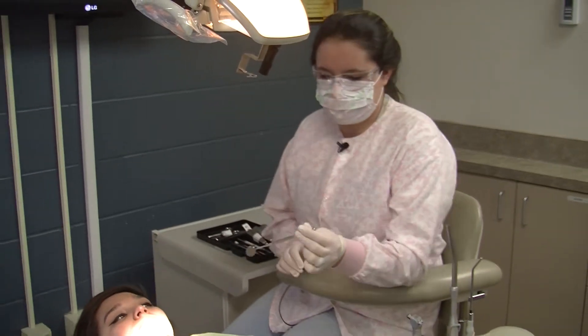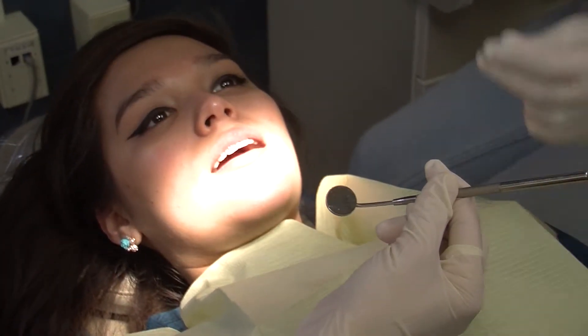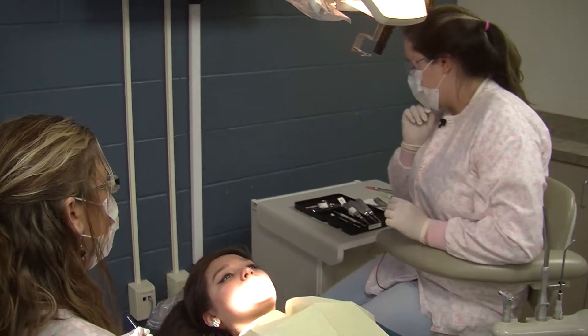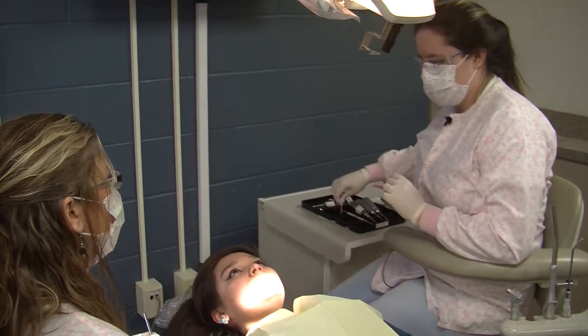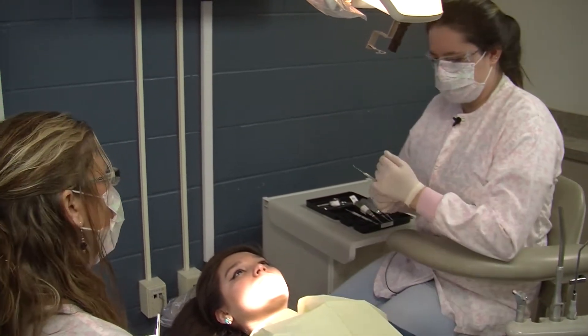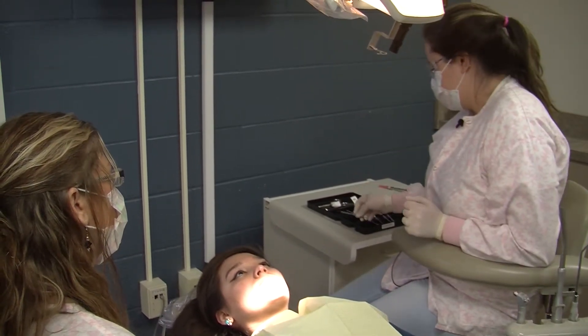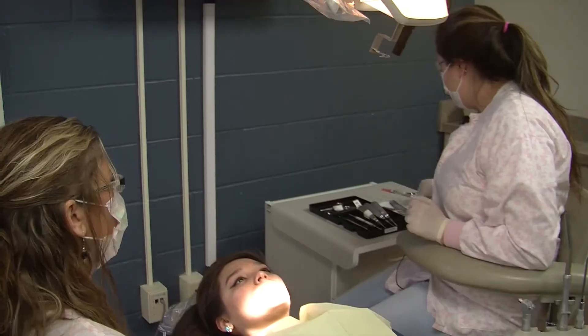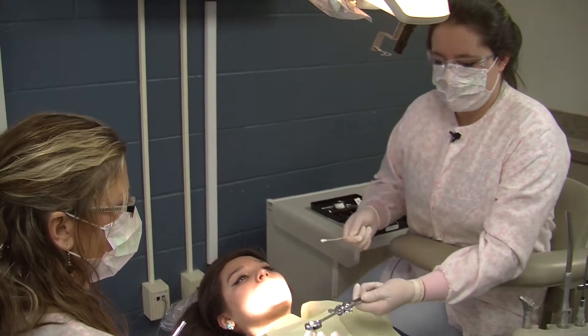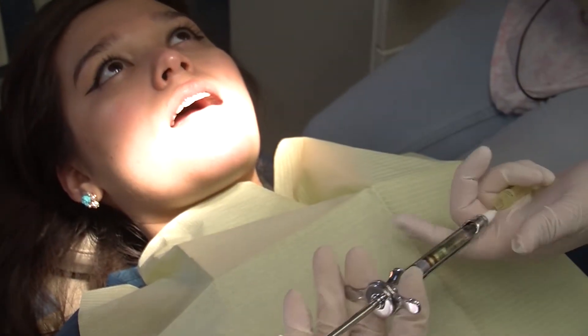The first step is the mirror and explorer. We pass with our left hand and grab with our pinky — it's easier for the dentist to grab. Next step is going to be the anesthetic and the topical. The anesthetic you're going to use so you can numb around the gums to inject in the needle. Then we're going to do the shot and we grab with our right hand. Carefully take off the lid of the shot.